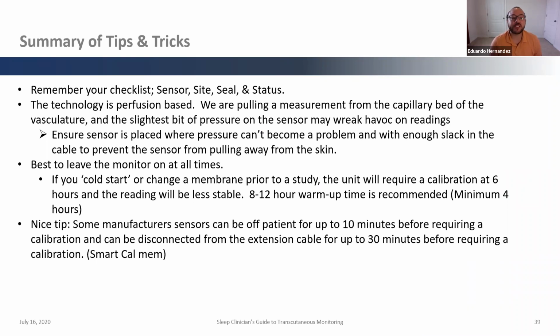So a quick little summary here. Remember your checklist. Before you're about to place a sensor on this patient, you're going to want to start in order: sensor, site, seal, status. This is all perfusion based. So we are pulling from the capillary bed, from the skin here. And even the slightest bit of pressure could alter your readings.